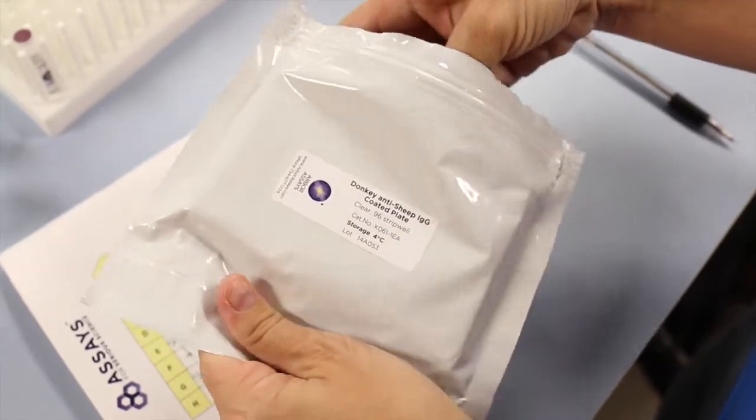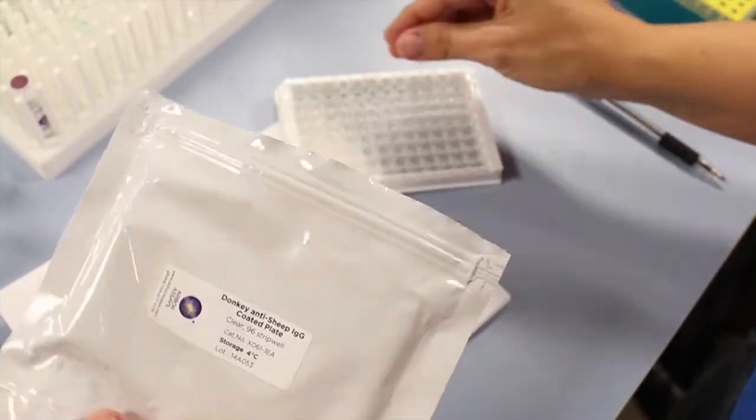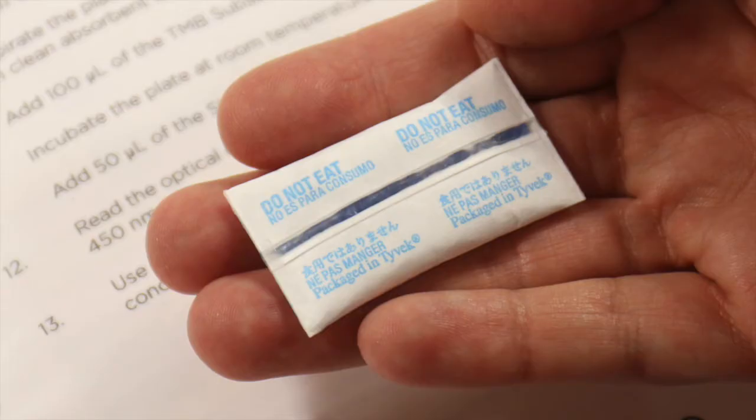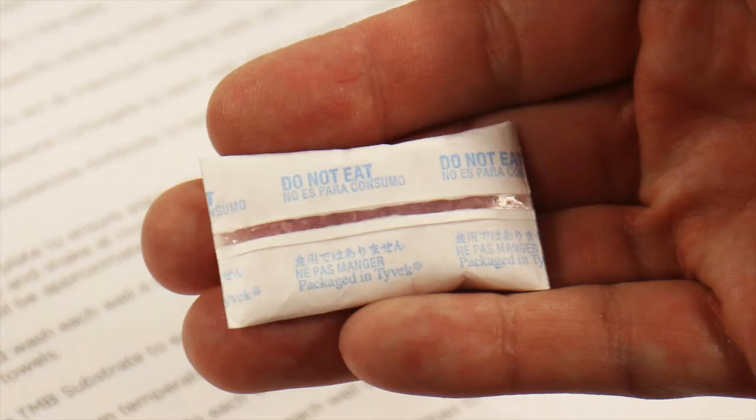Remember, always allow reagents to reach room temperature. Check the desiccant pack included in the pouch. It should be blue as shown. If it looks pink, do not use the plate and contact us immediately.